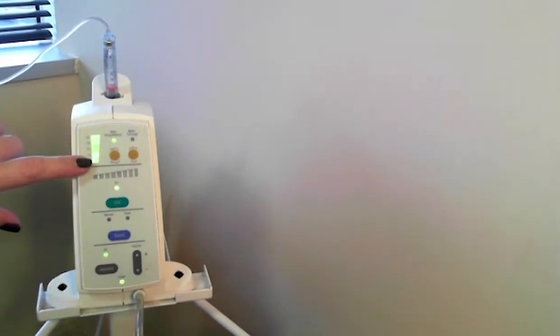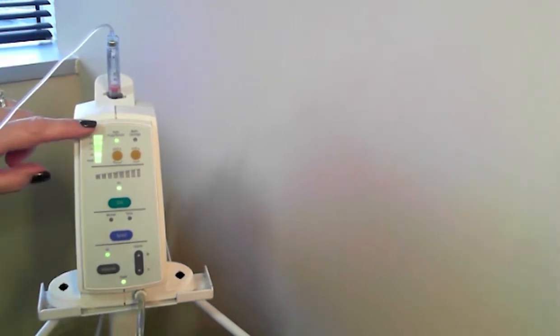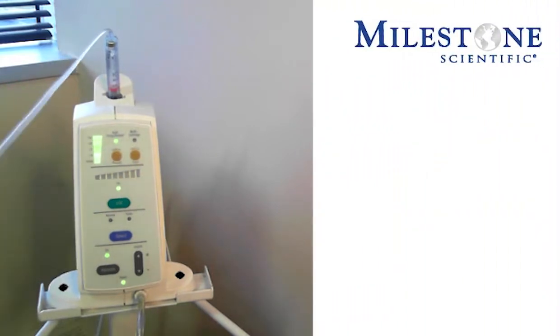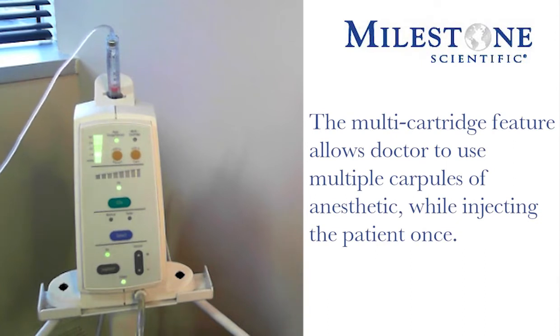You see that we have our vertical scale lit — that is our volume indicator, showing how much anesthesia we have in this anesthetic carpule and how much anesthetic we will be delivering to the patient. The instrument also has a multi-cartridge feature, which allows you to use multiple carpules of anesthetic and inject the patient one time.